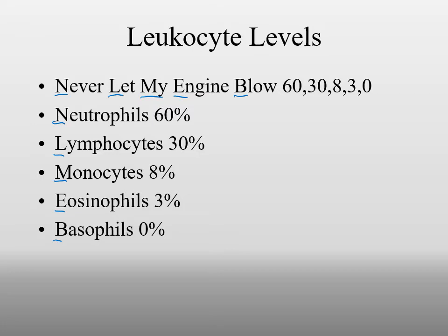When you do a white cell differential count, you're going to look at the individual cells and count 100 cells. As you count those 100 cells, the old way would be to make a tally as you go along and keep on tallying them up as you keep counting them. And then we see a couple more, etc. Those different white blood cells are going to have different numbers as we count those 100 cells in that particular part of the slide itself.